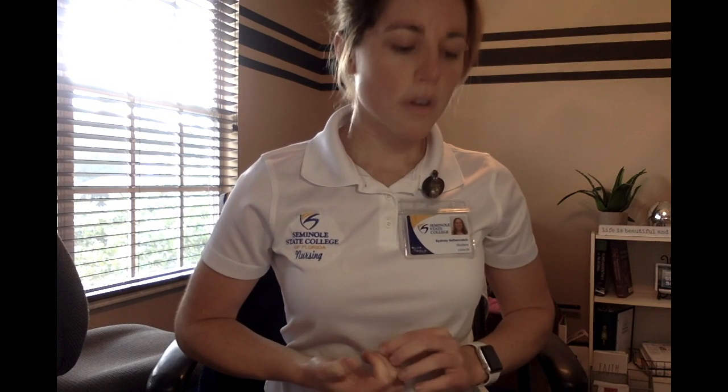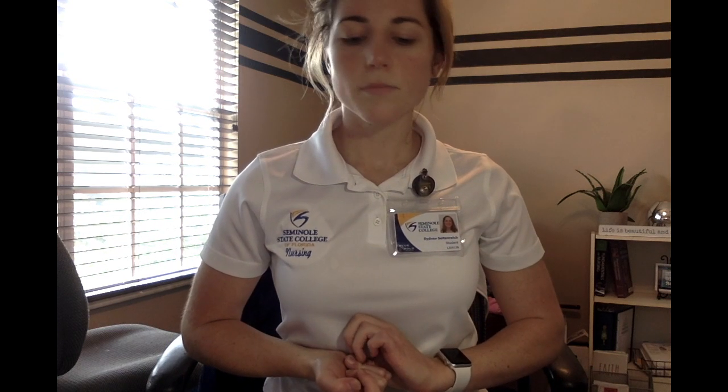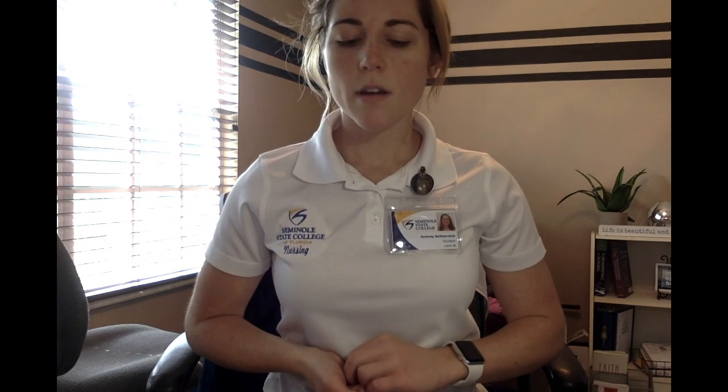So again, Anna Polowski, 05/05/1957, an order for vitamin B12 to be given subcutaneously, 500 micrograms or 0.5 mLs for today's time and date. And then, okay, so we did our third check. We know it's safe to give. So now we can go ahead and position the patient. So I'm going to have the patient sitting up and having their arms relaxed at their side.